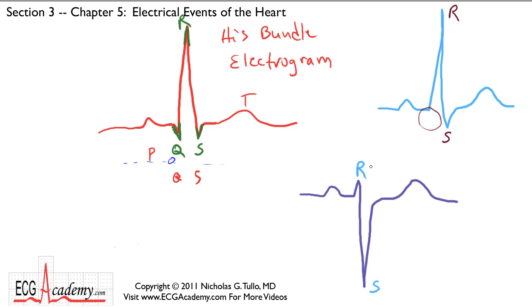And some people use a kind of shorthand to describe how the QRS appears. In this QRS complex, you have a tall R and a little s, and some people will write it this way, as big R and little s, whereas this QRS complex would be written as a lowercase r and a tall S. That's how we name these signals coming from the ventricle. So it can look all different. It can look crazy. These two signals have no Q wave.